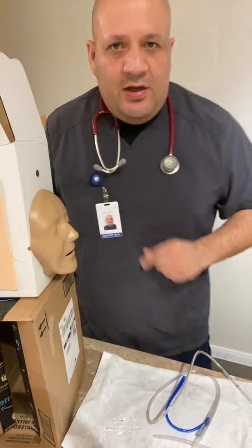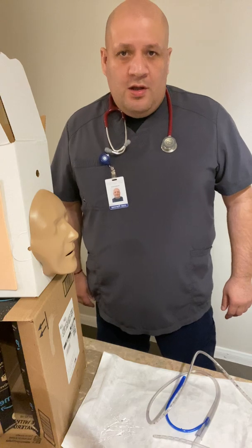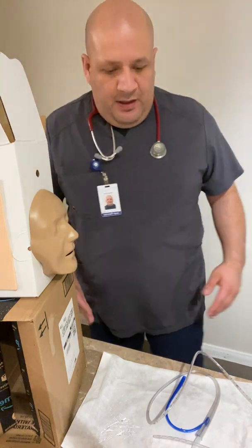I'm going to be doing a video on NG tube placement. So first I'm going to check the patient's orders. Make sure he has an order from the doctor to place a NG tube. So I checked the orders and he does have an order. I'm going to go ahead and gather my supplies.